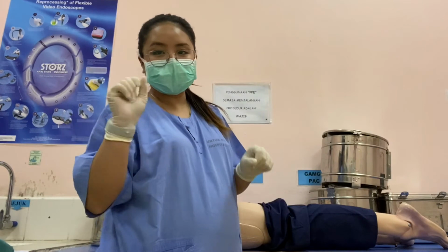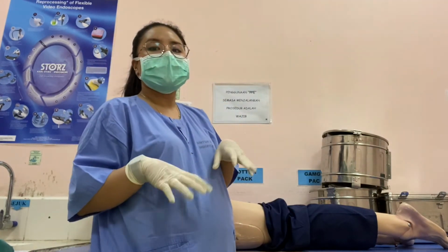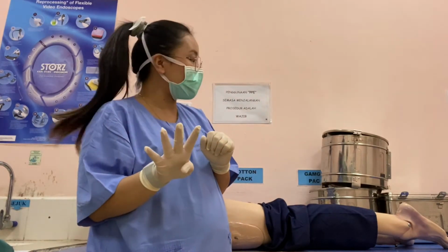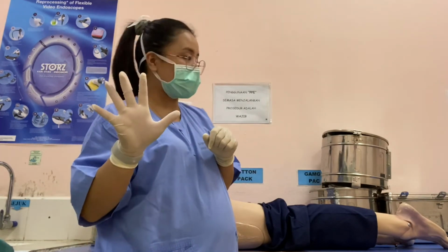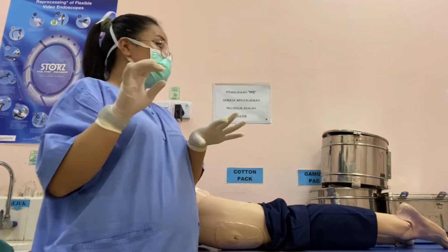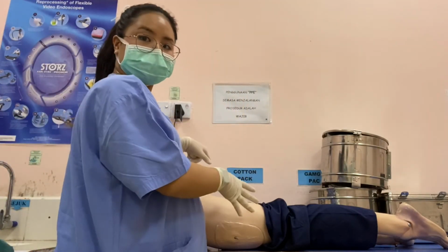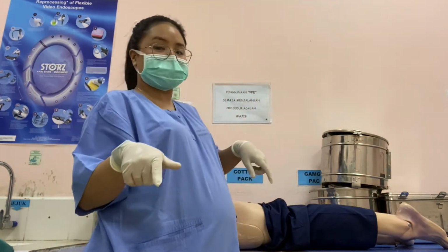So next, the fourth place you can give are the vastus lateralis site, and the fifth is the rectus femoris site. The vastus lateralis and rectus femoris are at the same side, at the side of your thighs.